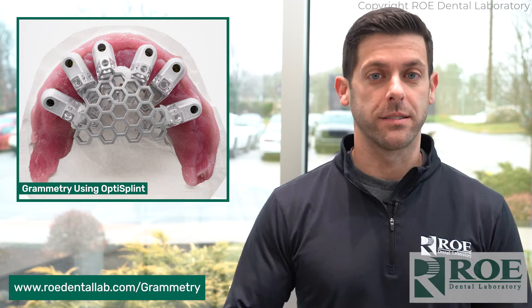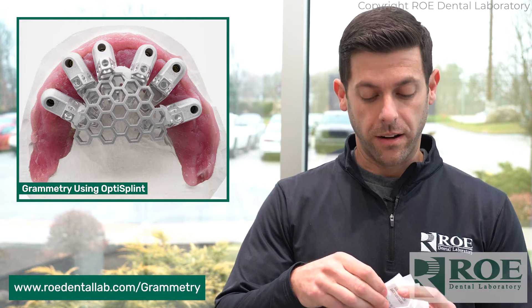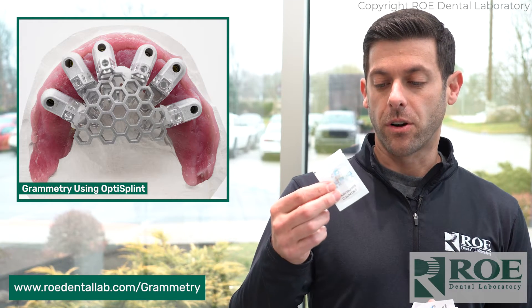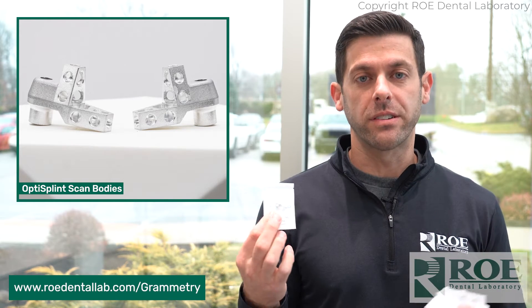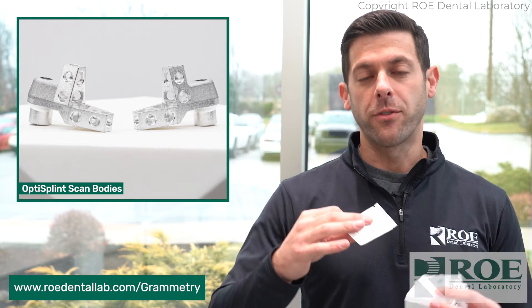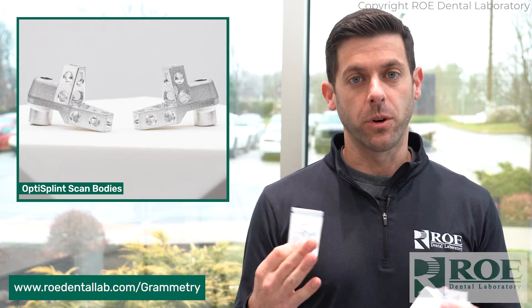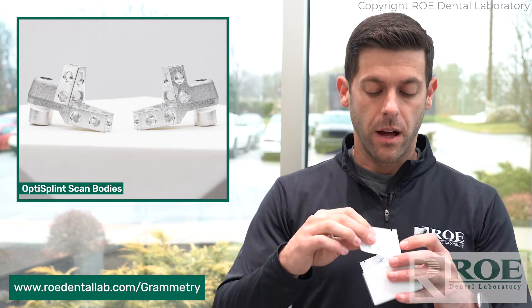It's 1% of the cost. All you need is your intraoral scanner. Now we have these — they're called OptiSplint scan bodies. Just like your standard scan body, it's going to screw right into your multi-unit abutment. If you want to go into details of how this actually works, we have a bunch of great videos on this. This is more of just introducing the OptiSplint itself.